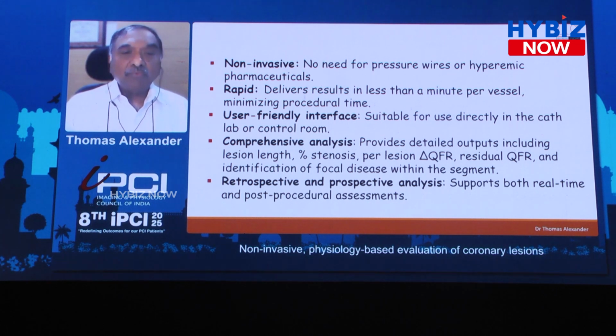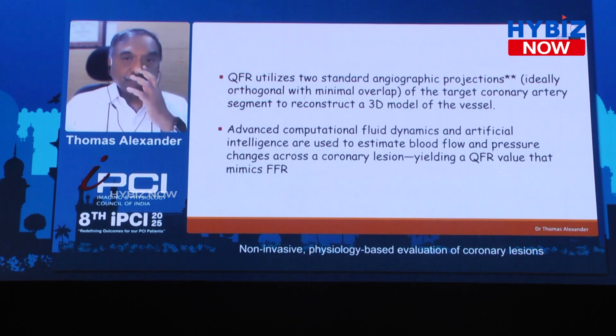So if somebody comes with a CD to you with some lesions which they think is borderline, you can put it into your computer, use the same software, and get the QFR read immediately so that you can make a decision. However, there are some caveats to that. These angios should be done in a certain way to make sure that analysis is possible.